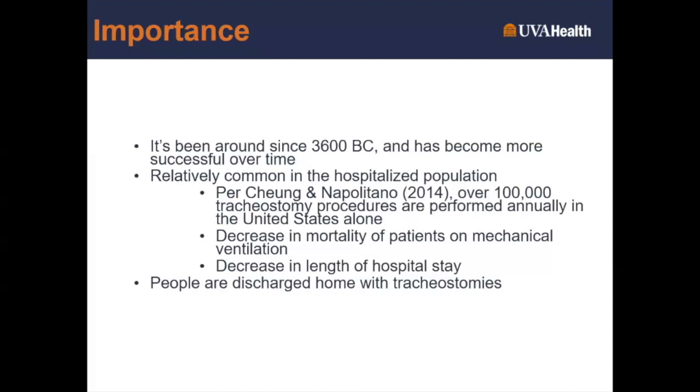Why we're talking about them is that this isn't necessarily just a hospital thing. This isn't people in the ICU that only they'll see it. This can be seen anywhere because people are in fact discharged home with tracheostomies. So they may come back to the hospital. So they may, for our pre-hospital friends there, need to be transported. So you need to know how to work with a tracheostomy. Or maybe this patient is admitted for something completely different. They broke their arm, and now on an orthopedic floor, you have a patient with a tracheostomy. So this is something that is certainly pervasive throughout all patient populations to kind of keep in the back of your head.